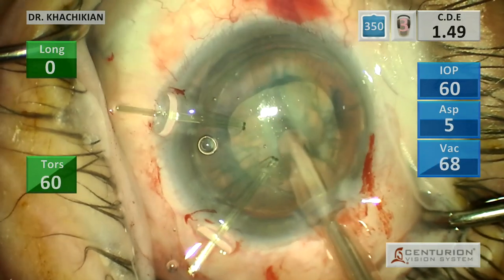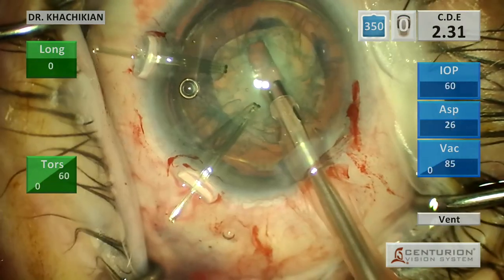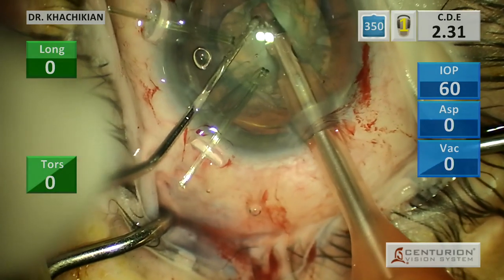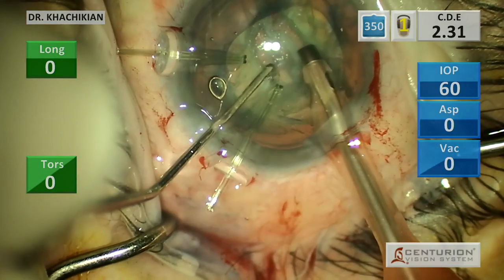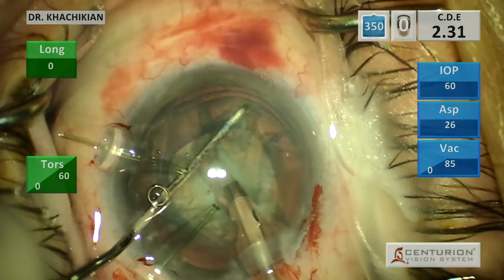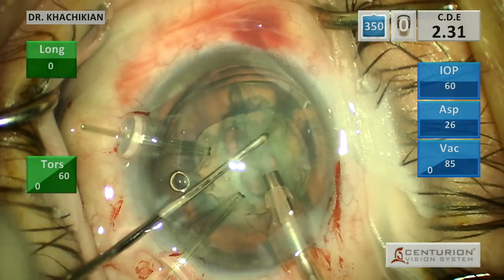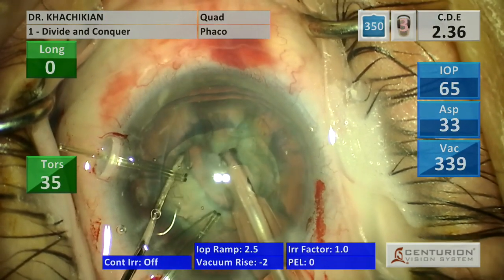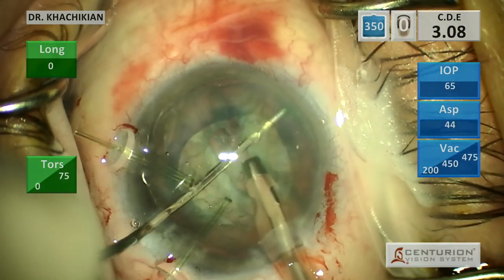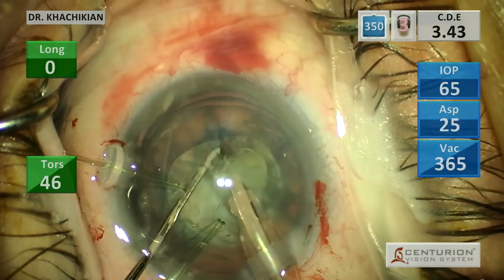I think I could have argued not to place these hooks before the surgery. It looks like the lens is stable enough that if I did a gentle phaco, I could have gotten away with using either none or one capsular hook. But you don't really know that when you start - you're just thinking: how loose is this capsule, and how much manipulation am I going to have to do to the lens to get it out? Is that going to cause more tension? So you want to put them in a case like this.